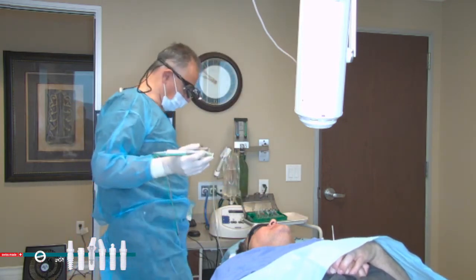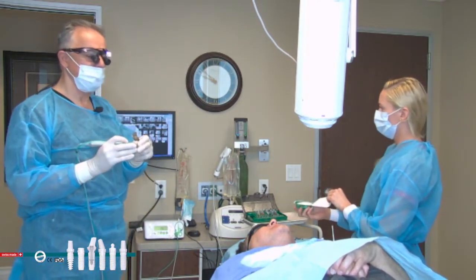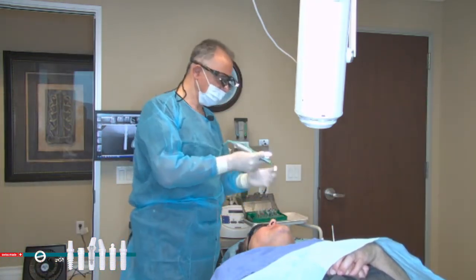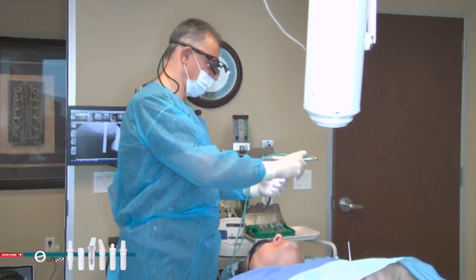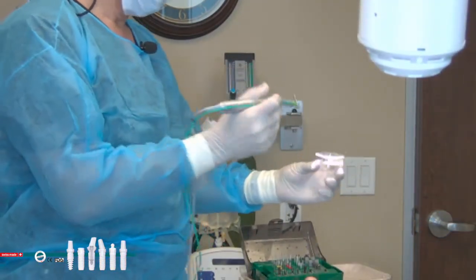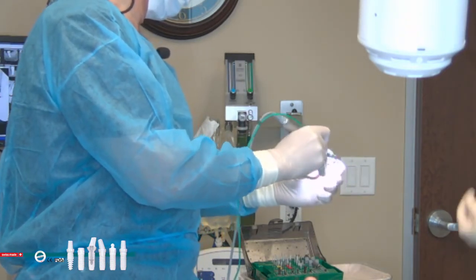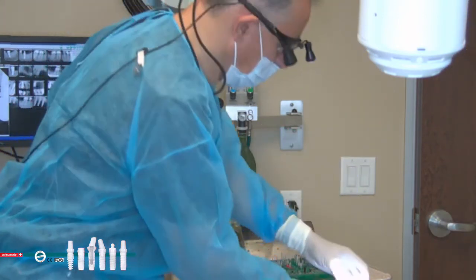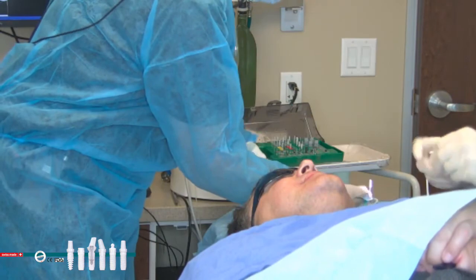And you put your motor on 20 Newton centimeter. And you have your assistant open the implant for you. And you take this and you peel off the top. And you just place this delivery system over the implant. I'm about to place the implant, so when I let you know, I want you to open as big as you can and stay open. And hold it over your surgical site in case the implant comes off, it'll still be sterile.